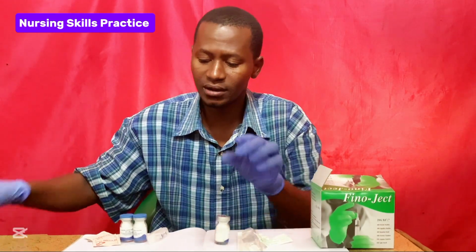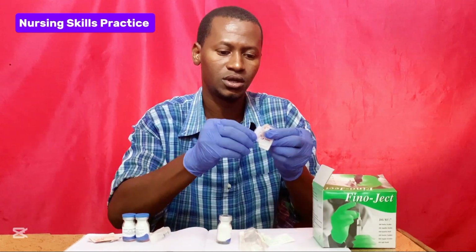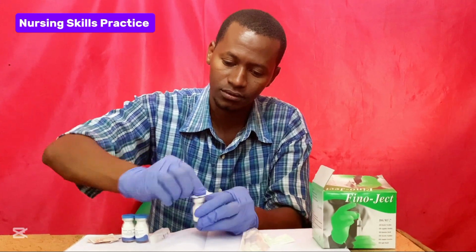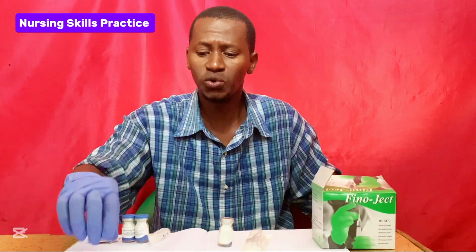You open the vial. Then you get an alcohol swab. So this is an alcohol swab. You clean the opening of the vial first. Then when you have cleaned it, you get the sterile water for injection.